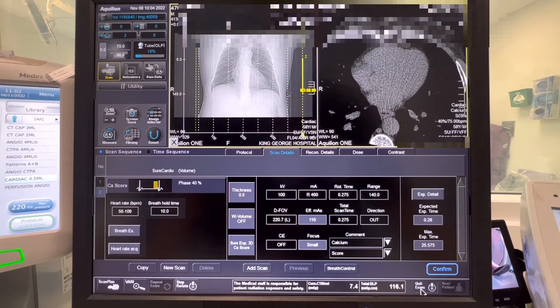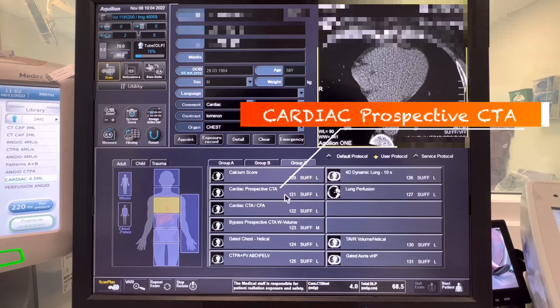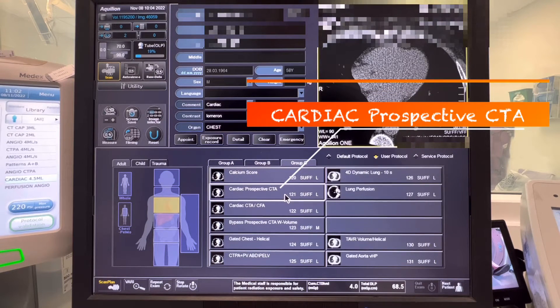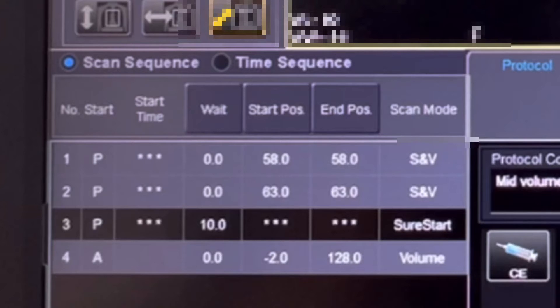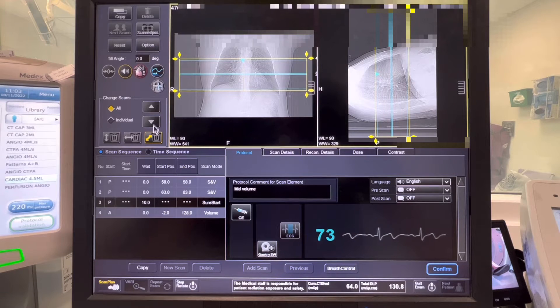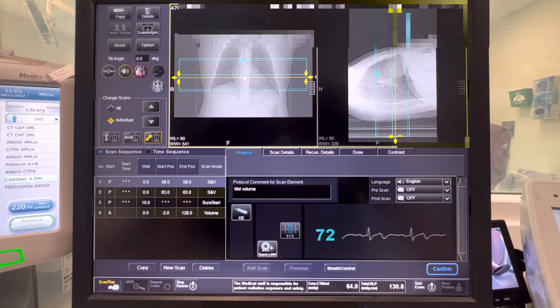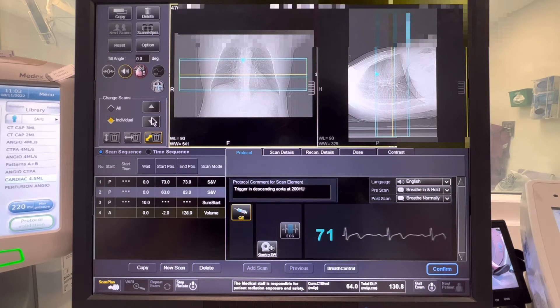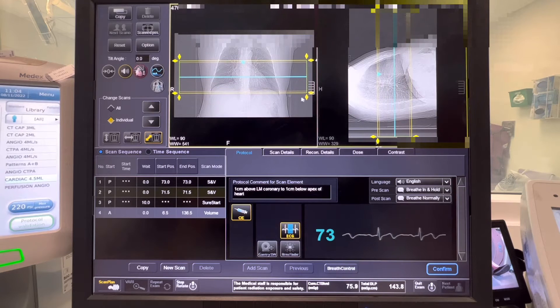After finishing the scan, press quit exam and choose the cardiac prospective CTA protocol for the cardiac scan. This is the scan sequence we are using for our CT coronary angiograms. Now let's plan the first sequence, which is the S&V or scan and view — place it on the widest part of the heart. The second S&V will automatically copy the first one along with the sure start. After that, plan the volume scan by placing the yellow box in the middle of the heart.